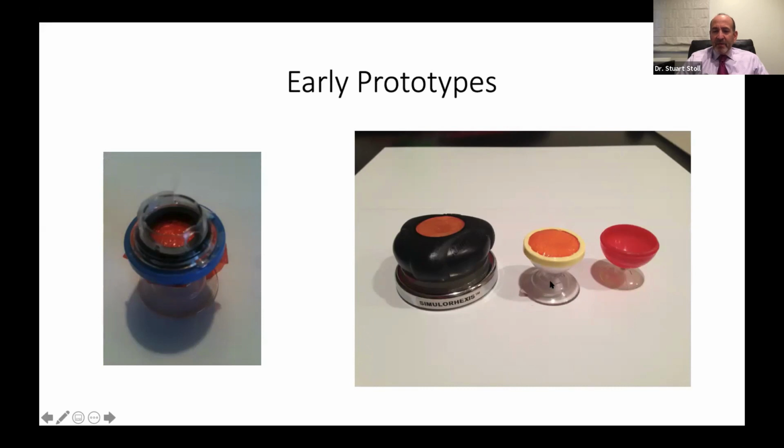And that came from just seeing one of my son's toys that he was playing with when he was really little. I thought, well, gosh, why not use a suction cup on the bottom of a model eye? And that gives us stability, but it also gives us rotation and eye movements. And so I literally went across the street from my office to the drugstore, and I got some of these little candies from the little game toy things from the vending machine for 50 cents.